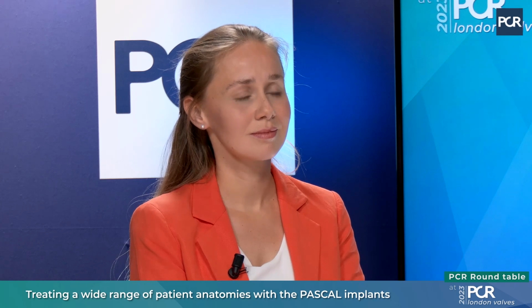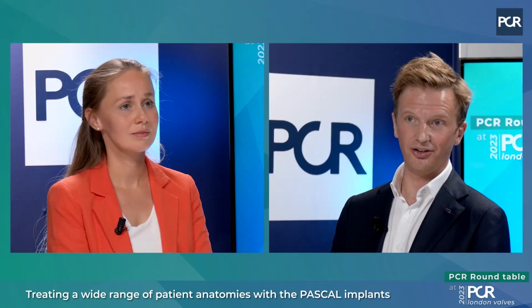Good. So that's a little bit of discussion on the PASCAL device in the mitral position. A really important aspect is treating tricuspid regurgitation, which is far undertreated, I think we would all agree. One of the aspects of the PASCAL device that works very well is it's the same device in the tricuspid position. The device isn't keyed, so you can set the steering to do whatever you need it to do, which lends itself very well in the tricuspid position. Turning to you, Mirjam, what features of the PASCAL device do you find useful for treating tricuspid regurgitation?